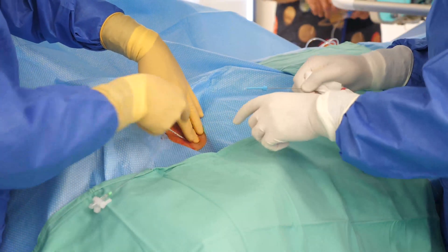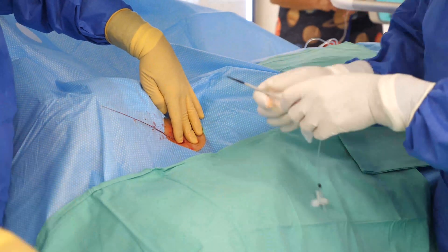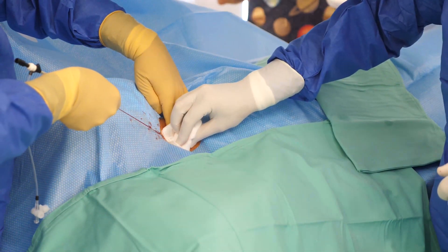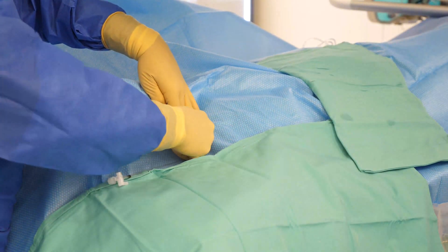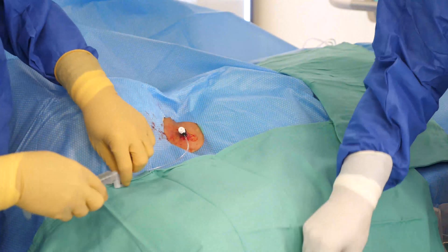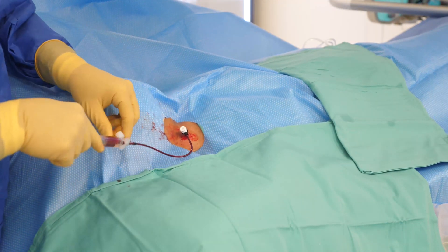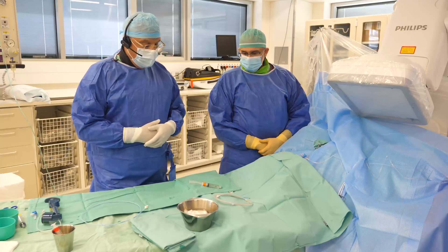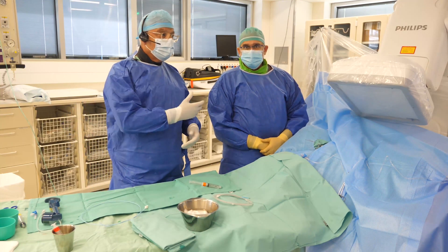Now that we have the six French sheath in, we exchange this to a nine French sheath. We flush the sheath and we make a suture to fix it. Now that we have the nine French sheath in, we are ready to start the procedure.